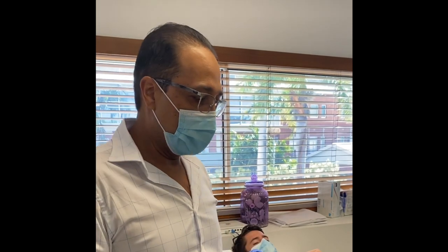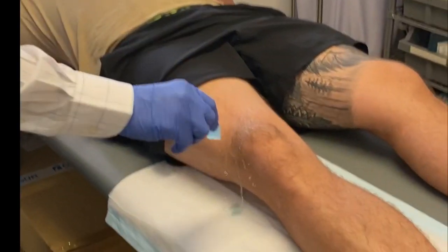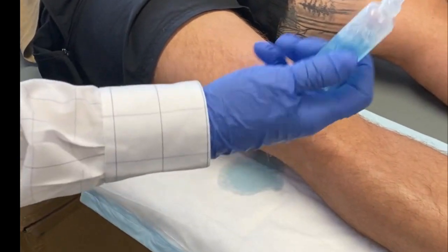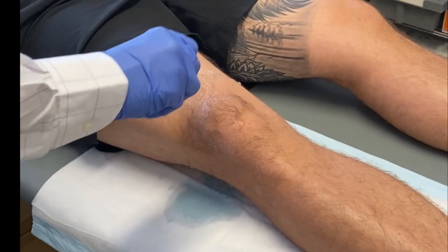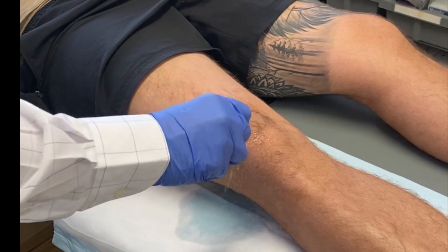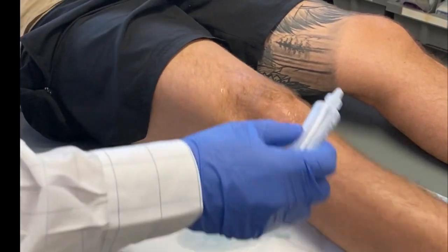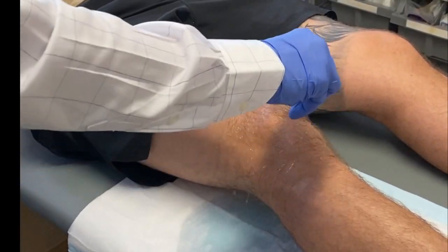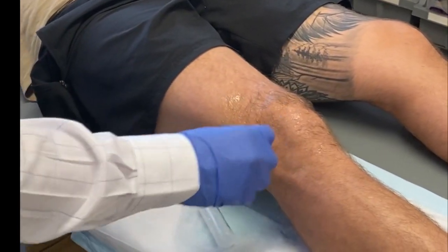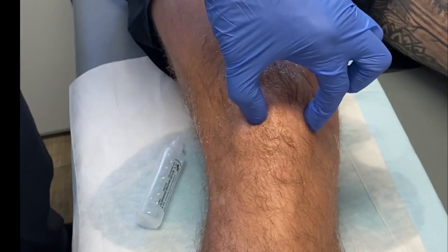The first thing is to make sure you disinfect the knee. Here we are — organizing our chlorhexidine or betadine, whatever you have. Ask the patient to internally rotate their leg.